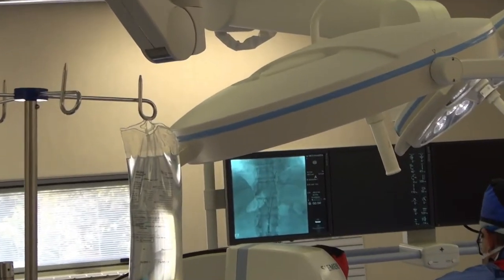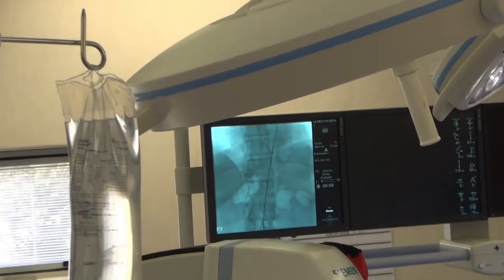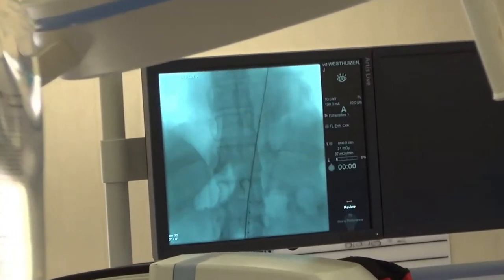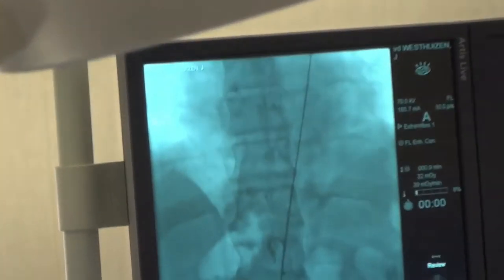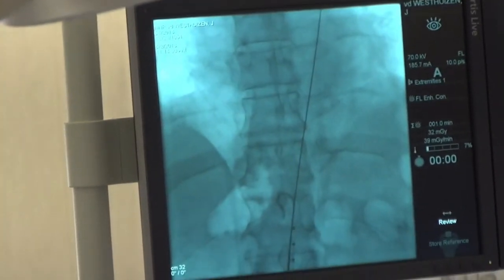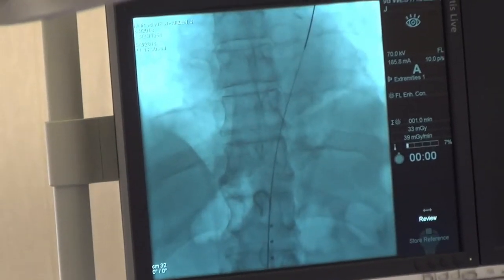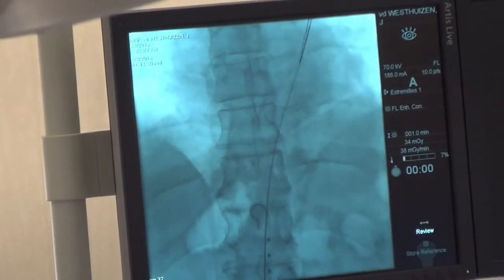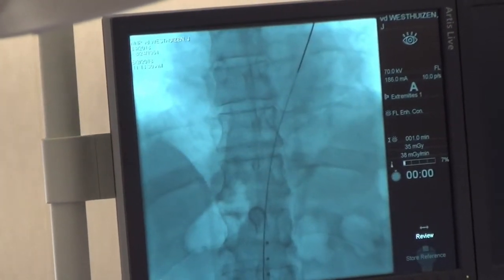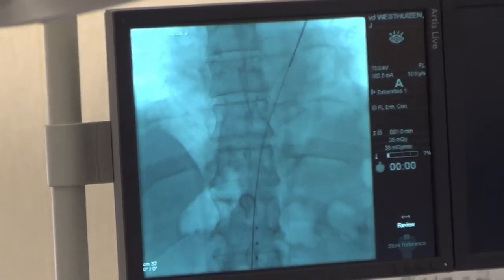On the other side, a soft guide wire is advanced before a catheter is placed over it, and a stiff guide wire is advanced through the catheter into the thoracic aorta.